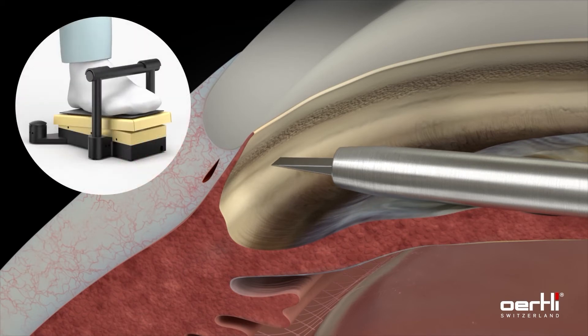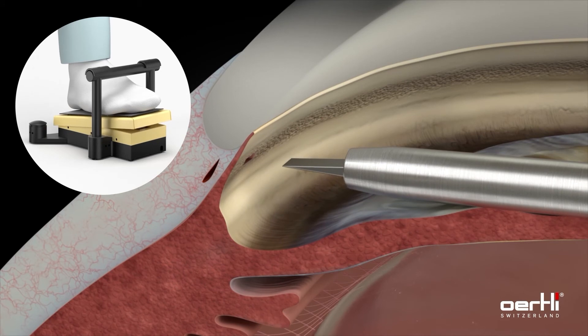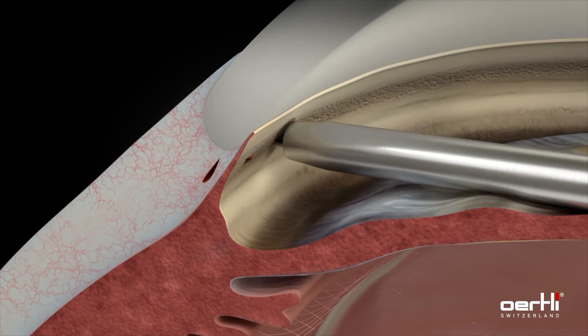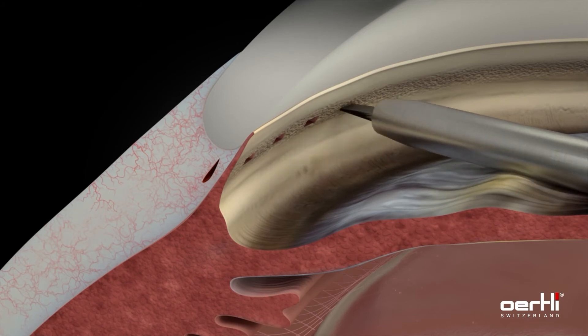Press the pedal and simultaneously push the HFDS tip forward to create the pocket, which provides outflow through the trabecular meshwork and Schlemm's canal into the intrascleral collector channels. With the third beeping sound, retract the HFDS glaucoma tip from the pocket while releasing the pedal slowly. Repeat the procedure and place five more pockets, for a total of six, close to each other.